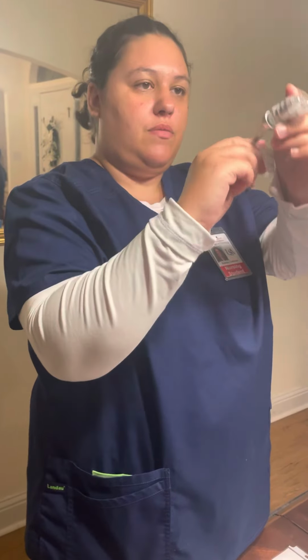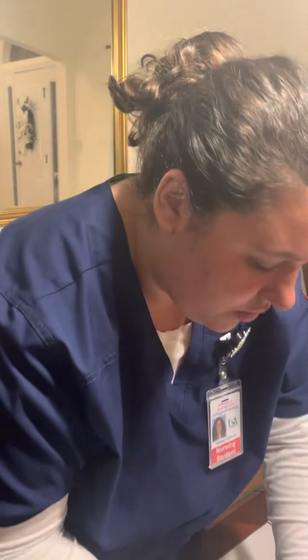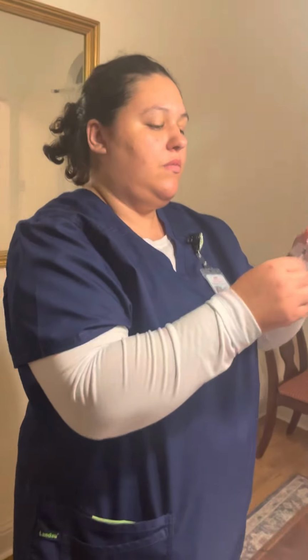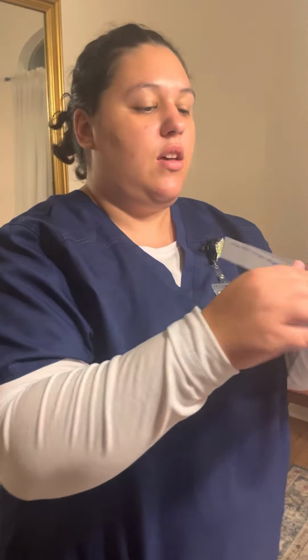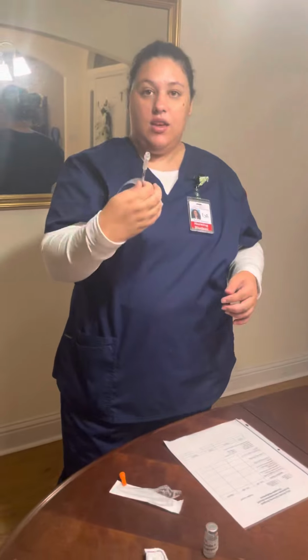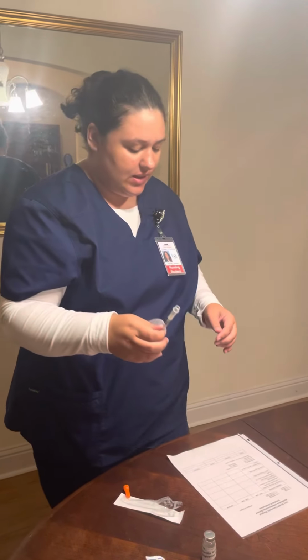All right, I've done 10 units of insulin, and then I would have my fellow nurse double check that I grabbed 10 units of insulin.